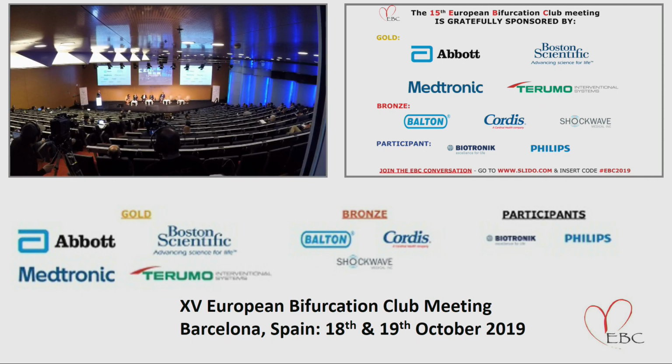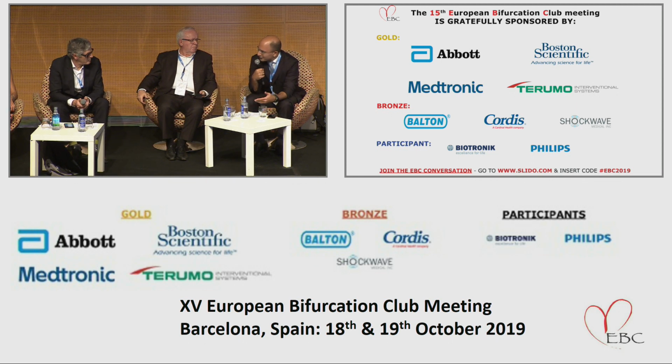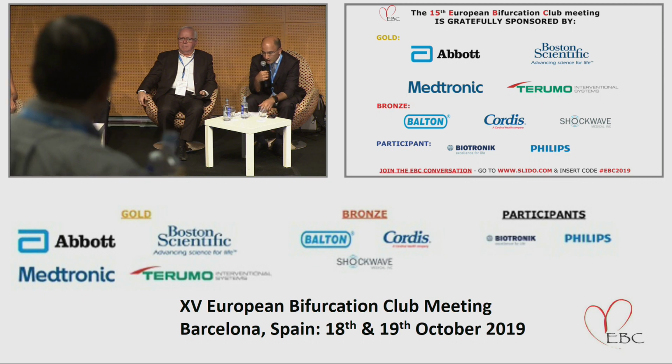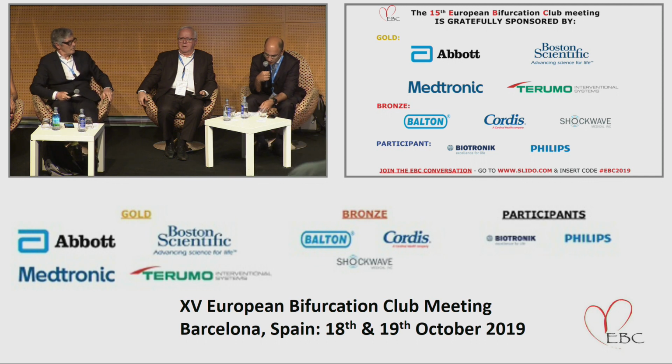So the question here again is what do we risk to open the strut towards the side branch? We have seen the presentation of Dr. Nakamura, and now it's becoming a little bit confusing because you have to do an OCT, you have to be in the right cell. You could do a bad job if you just open the side branch and you are not in the right spot. Regarding the kissing, I fully agree with what has been said. Maybe just a simple POT-side-POT will be enough. No need, for example, to do a kissing. That's just another question, just to open the discussion.